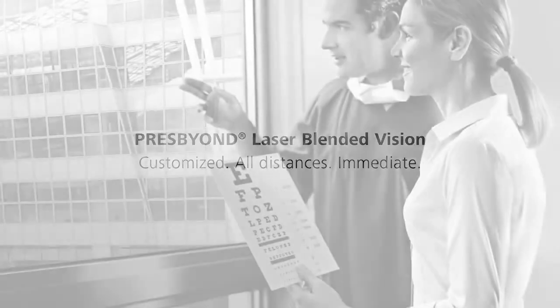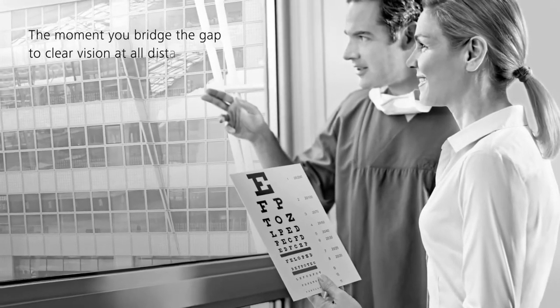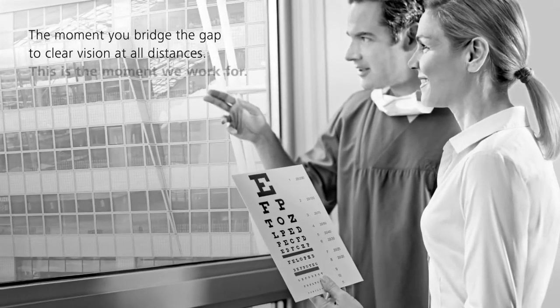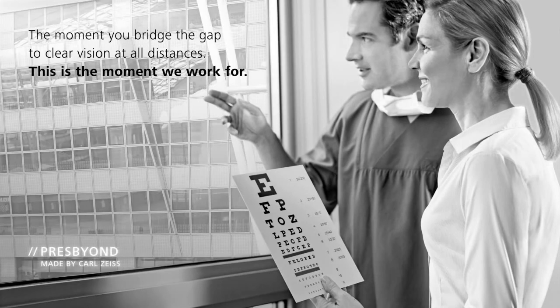PresBeyond Laser Blended Vision. Customized. All distances. Immediate. The moment you bridge the gap to clear vision at all distances. This is the moment we work for. PresBeyond. Made by Carl Zeiss Meditec.